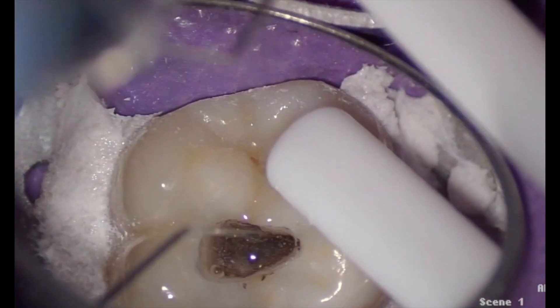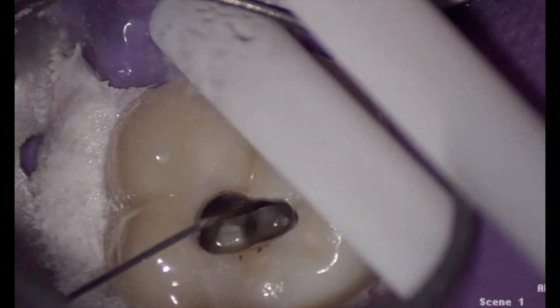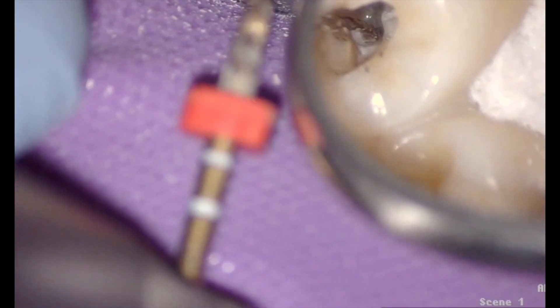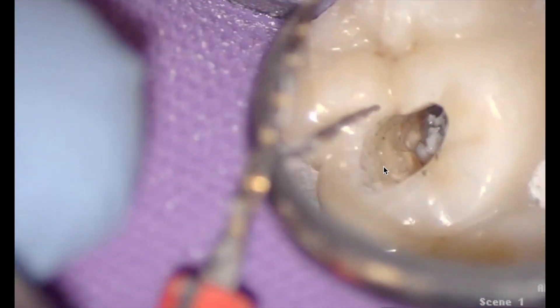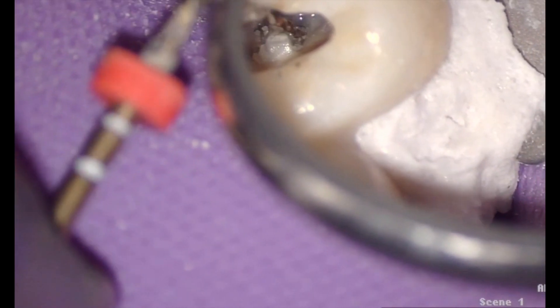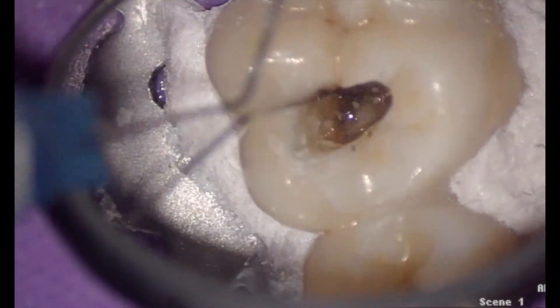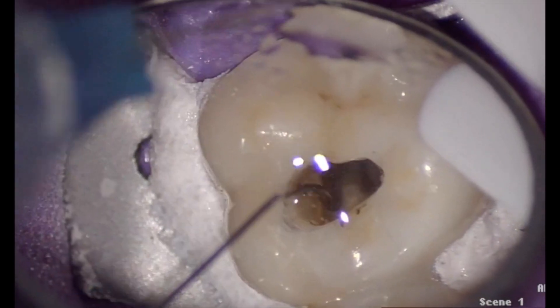The true concern is: when am I going to perf? You've got to practice on extracted teeth — that's one of the biggest things I teach our residents, students, and dentists first doing this stuff. Then I'm going to do the same thing with my MB1, opening that up with the coronal two-thirds, same with MB2. I don't get very far, but you can be very careful with this technique — I'm more concerned with ledging. So I open that up just a hair, then start with the 6-8-10 file progression.